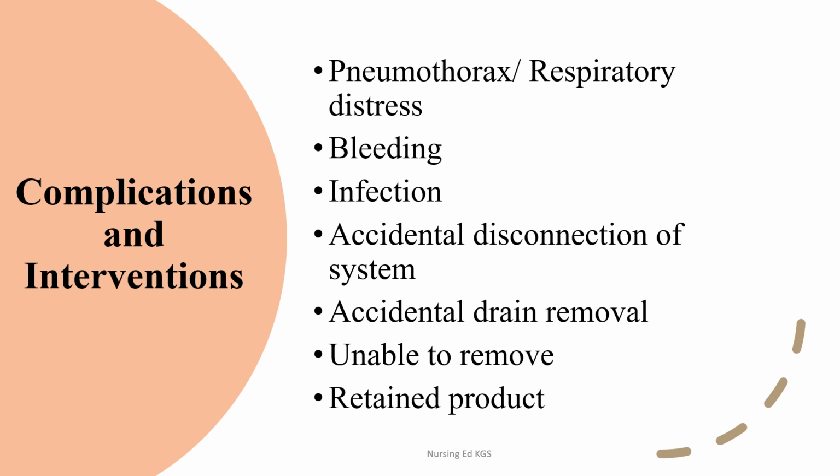And if this happens, if the tube just fractures while the doctor is removing it, or the doctor suspects that there are remnants of the tube that are left within the patient during removal, they'll immediately do a STAT or an urgent chest x-ray, and the patient should keep NPO if it is that they'll probably be going for surgery. You will also keep the entire drain tubing in the patient's room if it is that there need to be some quality review after, as well as ensuring that you're documenting according to your institution policies.